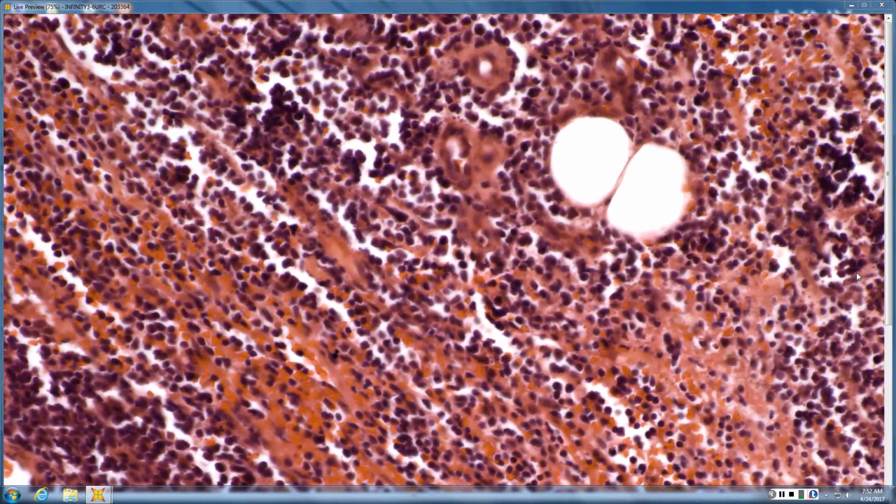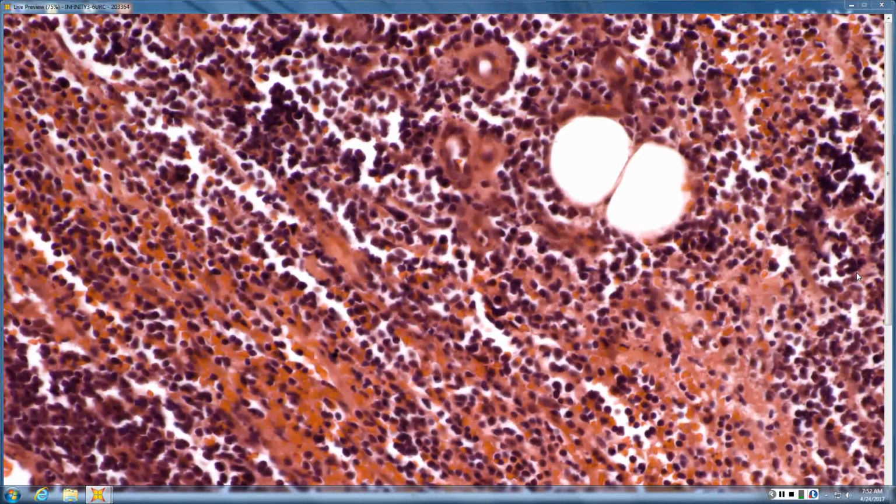Can't make out any germinal centers at all when you do a CD21. So there's really no dendritic network showing preserved germinal centers. They're all long since wiped out. But it's BCL2 positive. And it's MUM1 positive. What are you thinking? Diffuse large cell. What type?